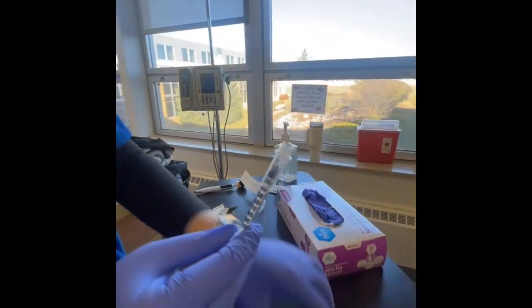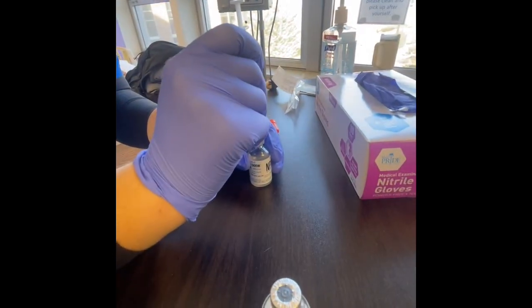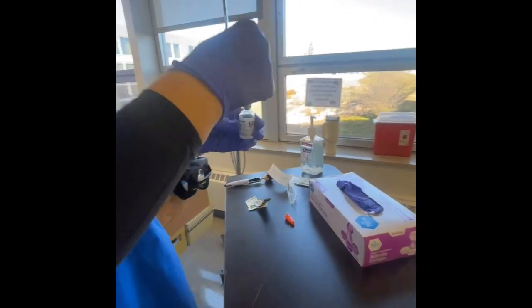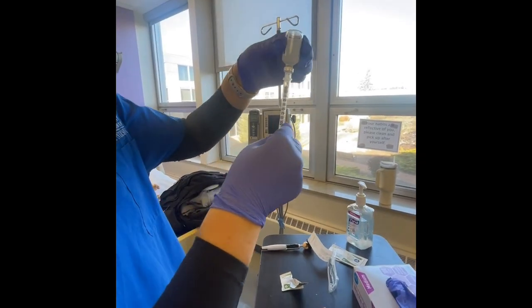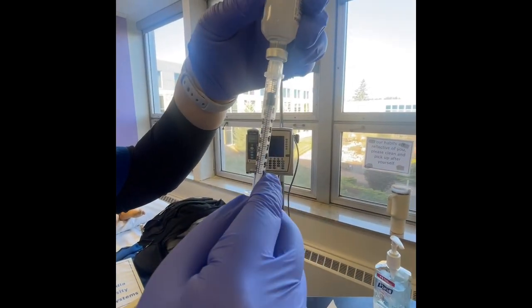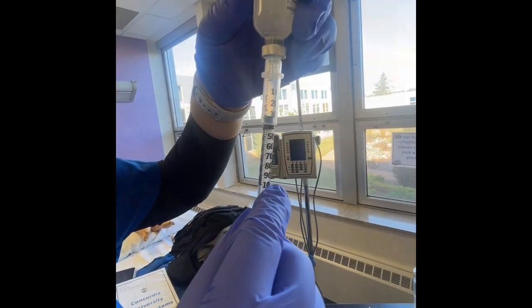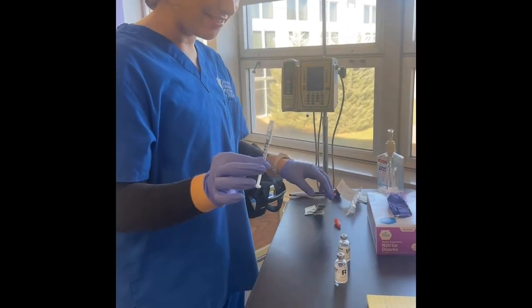Good. We have 14 units, and in this part you want to be very careful that you don't get any additional, you don't get the regular into the NPH. Give it a little roll. What happens if you go over the dose? Start over. And why? Because you contaminated the syringe and you might not have the right amount of insulin. So now we're going to go to 34. Be very careful. Perfect. Now we just pulled out of the NPH.